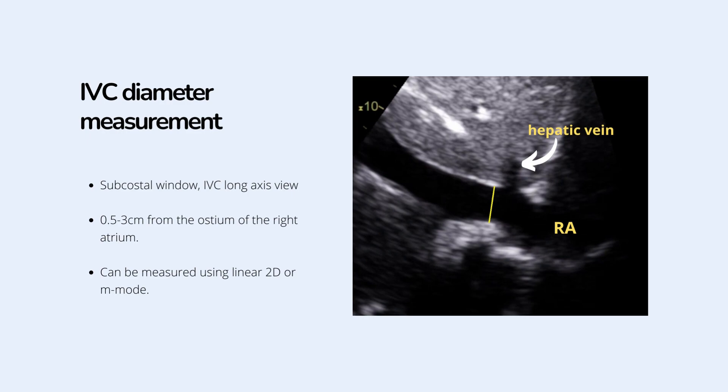Use the subcostal window with IVC long axis view. IVC is measured just proximal to the entrance of hepatic veins, approximately 0.5 cm to 3 cm from the ostium of right atrium. It can be measured by direct 2D linear caliper on maximum expiration and inspiration, or by using M-mode modality.